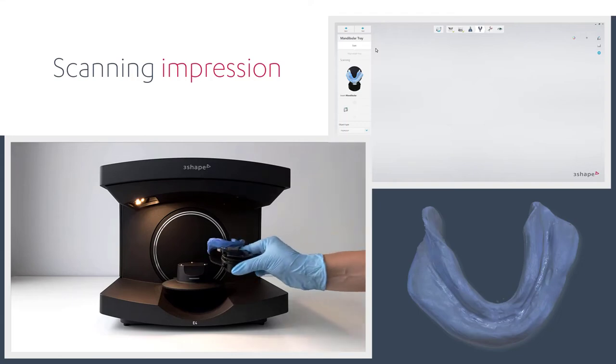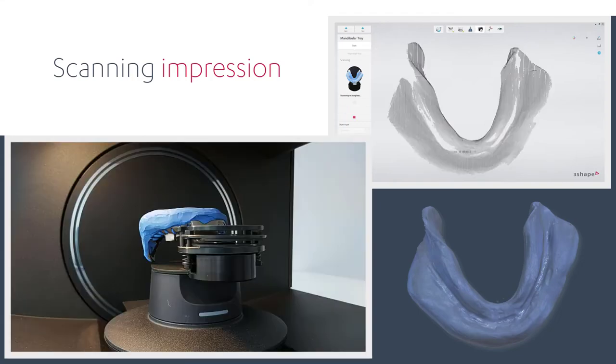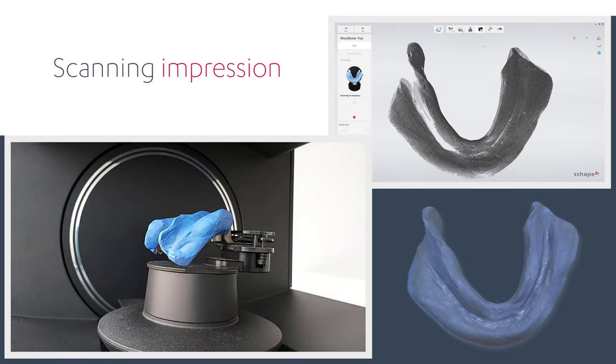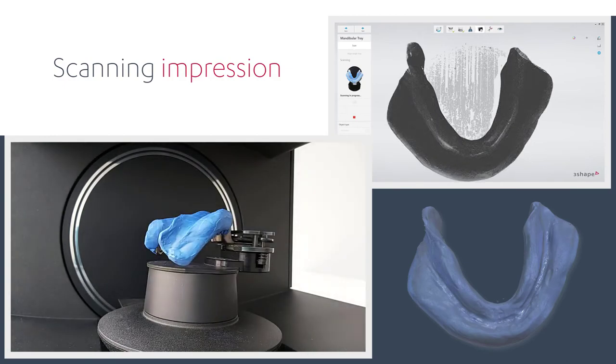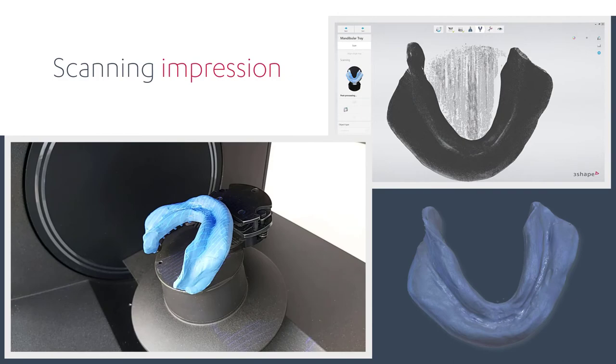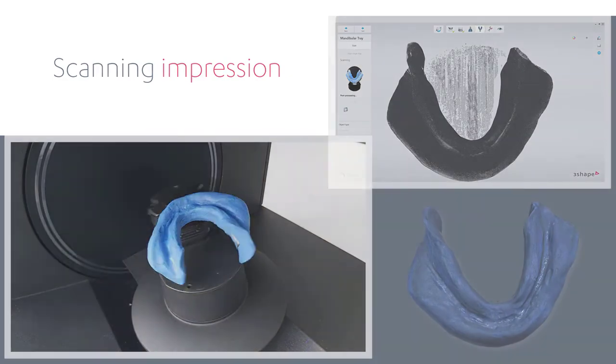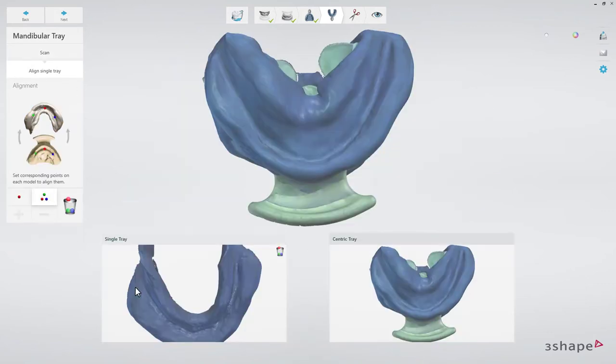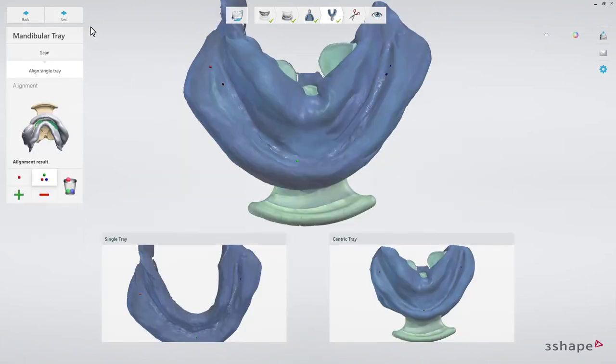Repeat the same steps for the mandibular tray. When it's finished, align the single tray to the Centric Tray. Click Next when finished.